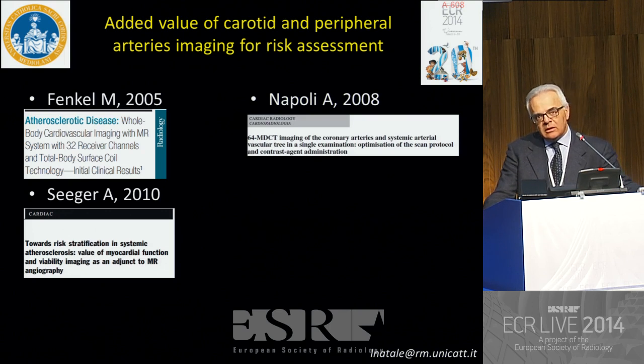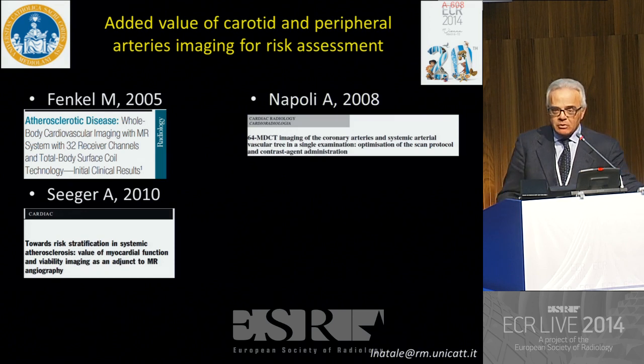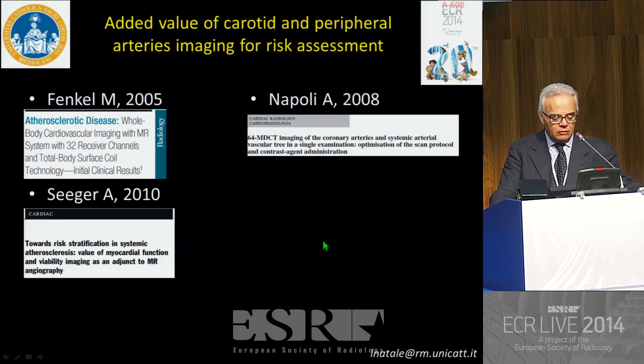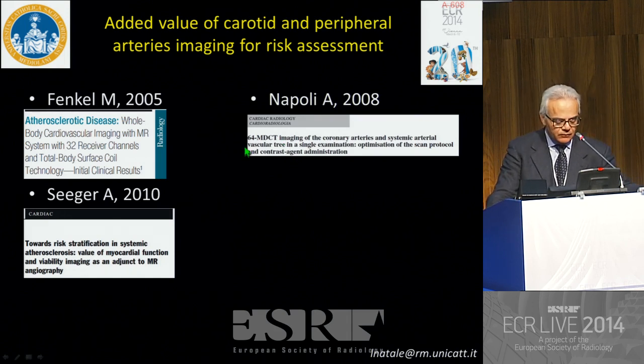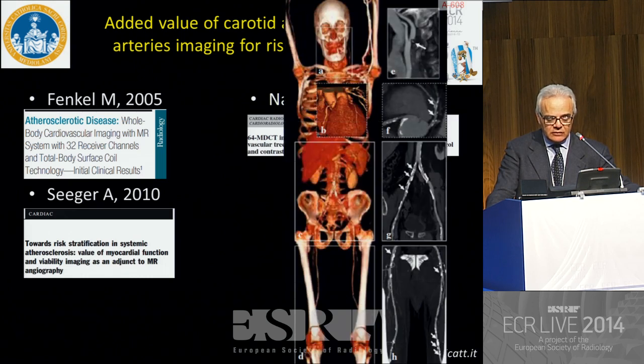In non-invasive imaging, non-invasive coronary, peripheral and carotid angiography increased this possibility because of the rapid development of techniques, both for MR with whole body imaging with multi-channel coils and automatic movement of the patient's bed, but also for CT. And there are some papers published in the last 10 years demonstrating the possibility of screening not only coronary arteries but also peripheral arteries in this way.